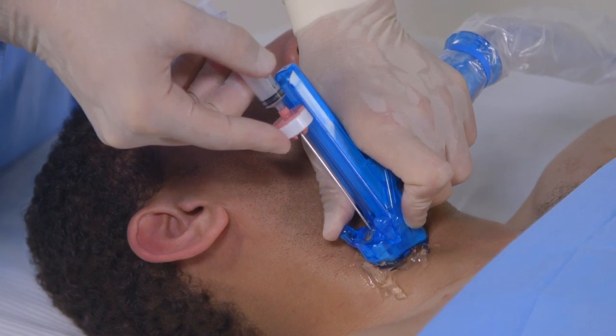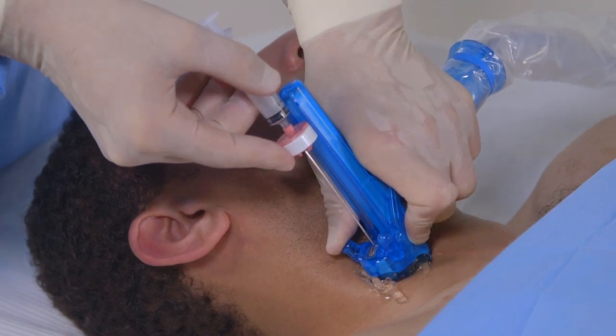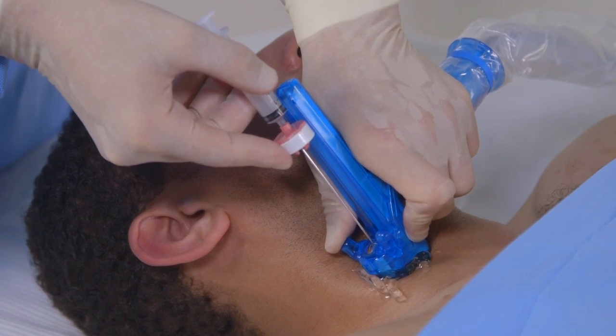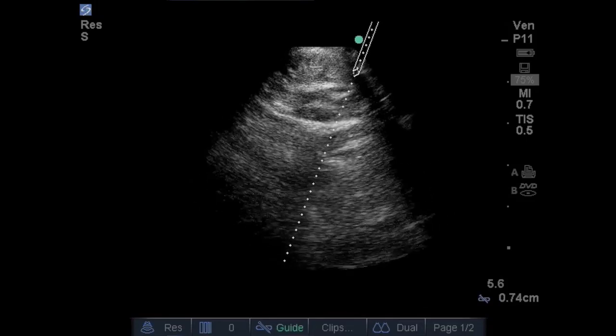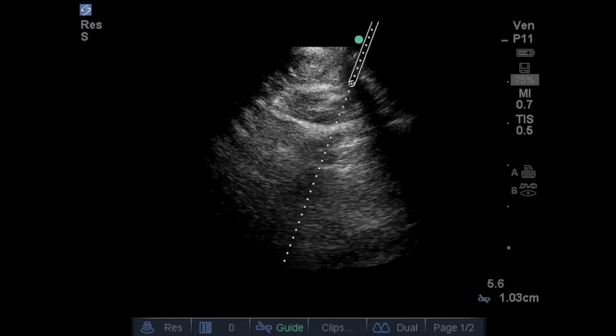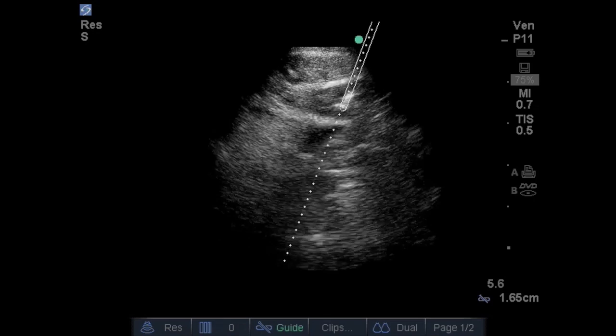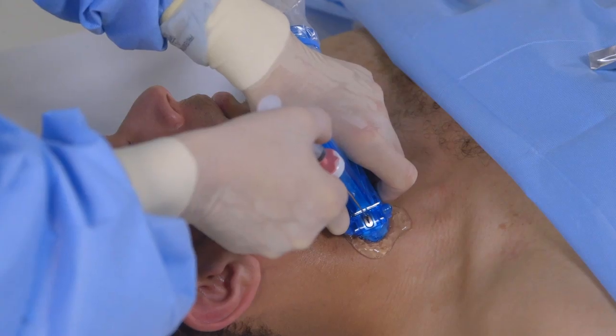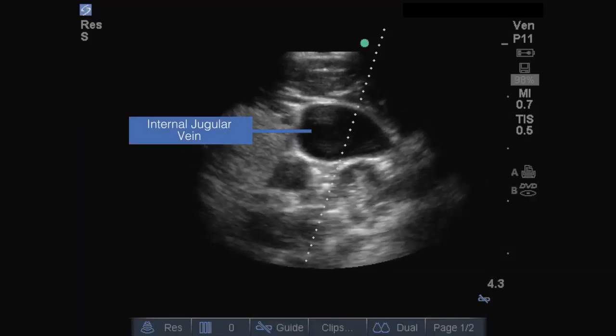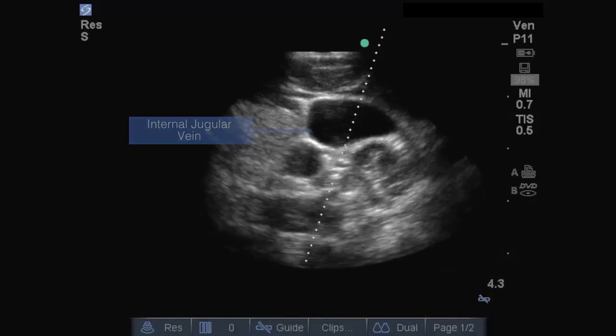Note that it may be necessary to apply extra pressure with the probe as the needle penetrates the skin to avoid losing the ultrasound image. The extra pressure can cause the IJ to temporarily flatten out, but you will still be able to see the important adjacent structures. Once the skin has been penetrated and the extra pressure applied to the probe has been relieved, the IJ will refill and be visible. Then, you can confirm that the target line is still located at the desired position on the vein and continue with the procedure.